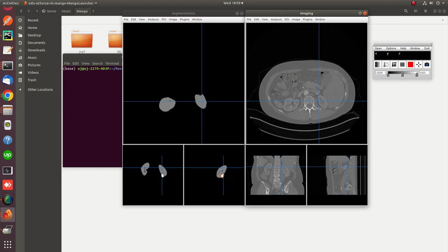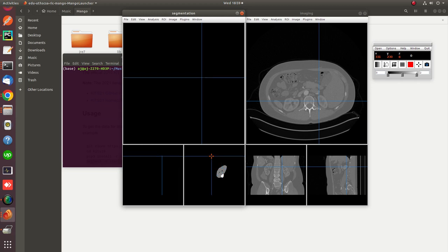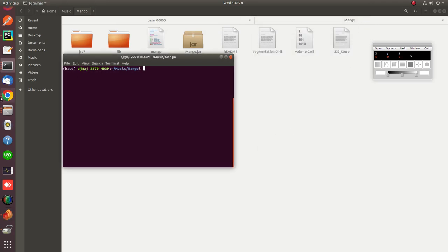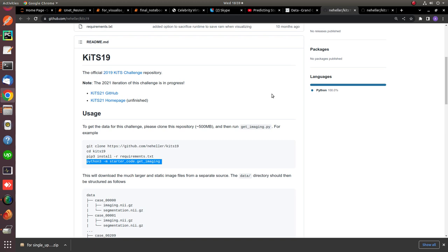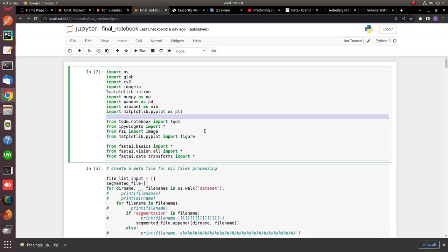The ultimate goal of the challenge is to create an algorithm that is able to identify the kidney from these images and thereafter locate the tumor portion inside the kidney. When I click on the tumor portion, on the top right window this represents the second class — the first class is the kidney and zero class is the background. So your goal is to segment the images and classify into three classes. This dataset is in 3D format, so you first need to convert it to 2D format, then perform segmentation and later reconstruct the 3D images from the 2D segmented parts.